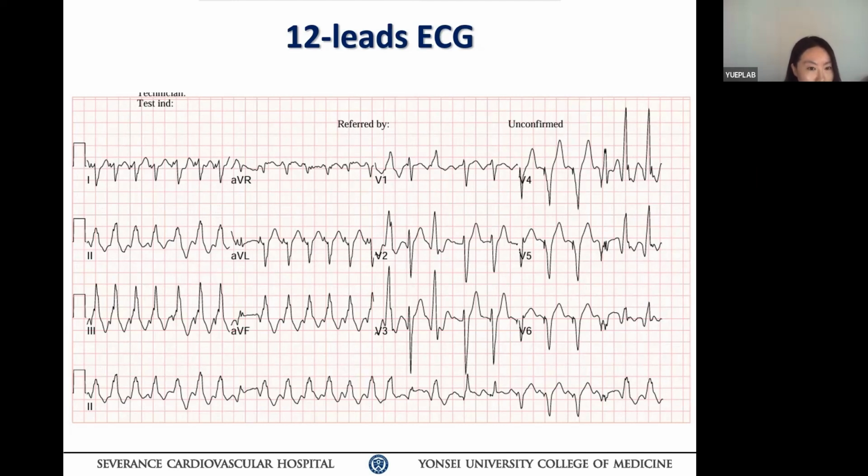Also, the termination is faster than the initiation in the aVR lead, so these signs say this is VT. About the location, as you mentioned, inferior leads and V1 are positive, and V3 and V4 as well. I think the second beat of V3 is the VT rhythm and the others are pacing rhythm, so V3 and V4 are positive. I almost agree with the VT origin, and that's my opinion.